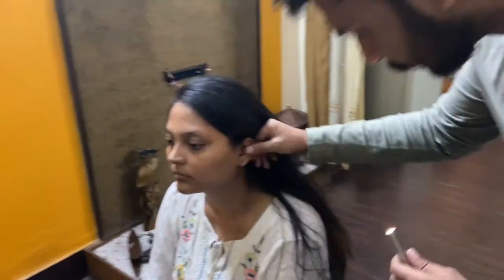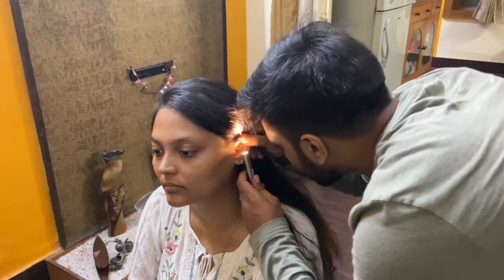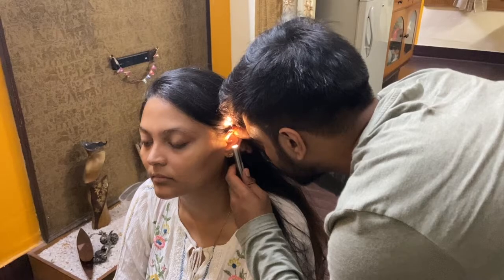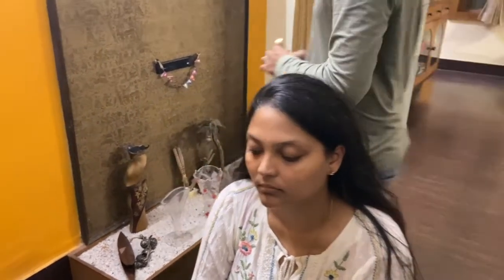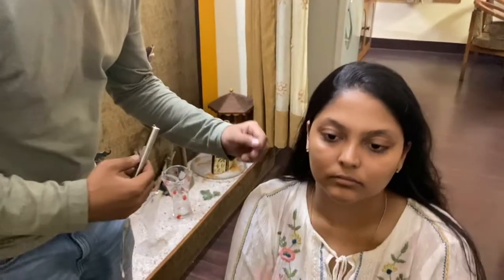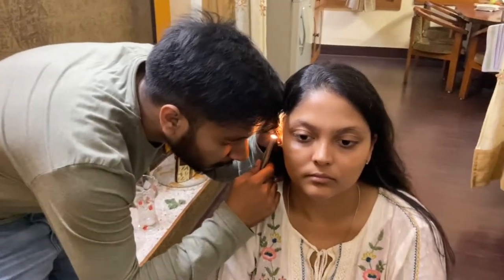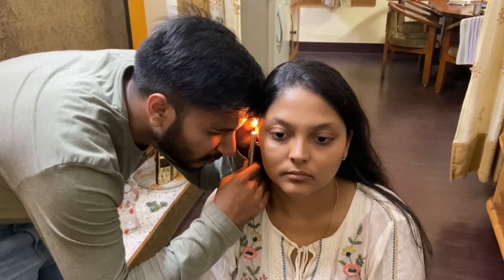Now I will have to inspect her ear canal and eardrum using an otoscope. I use my pen light as an otoscope. For this, I have to pull my patient's auricle upward and backward. Then I have to hold the otoscope and direct it downward and forward through the ear canal. There is no discharge, redness, swelling, or any foreign bodies noted. The eardrum looks intact.